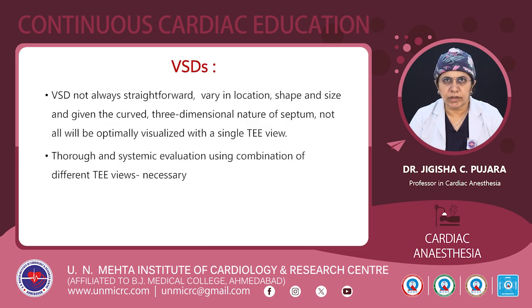VSD is not always straightforward; they vary in location, shape and size, and given the curved three-dimensional nature of the septum, not all VSDs are optimally visualized with a single TEE view. A thorough systematic evaluation using a combination of different TEE views with multiplane angles is necessary.